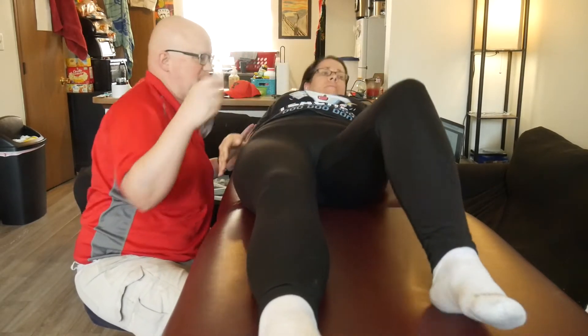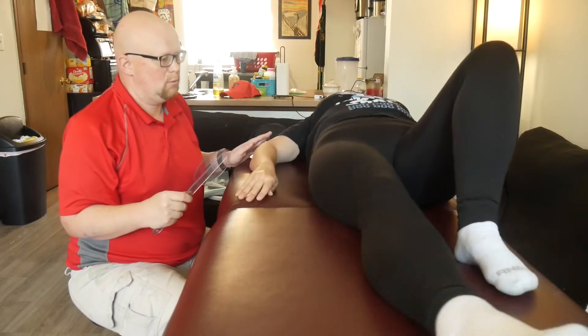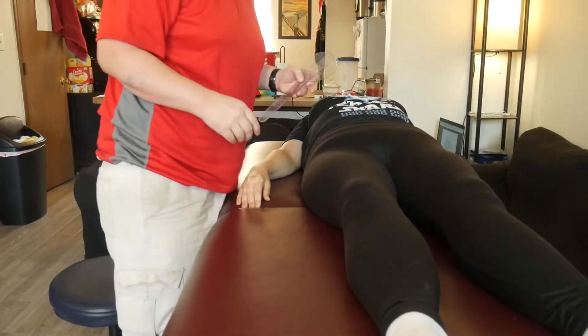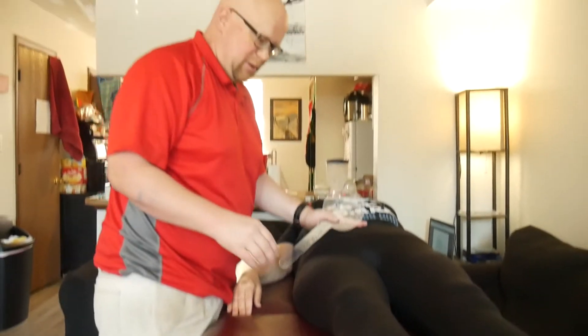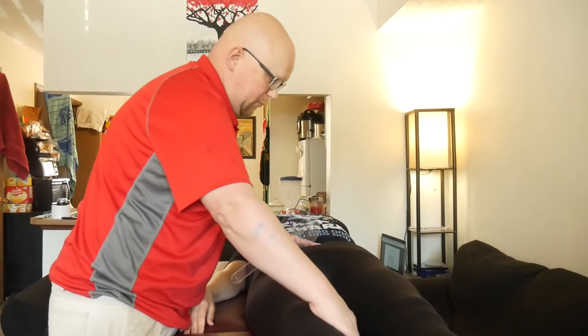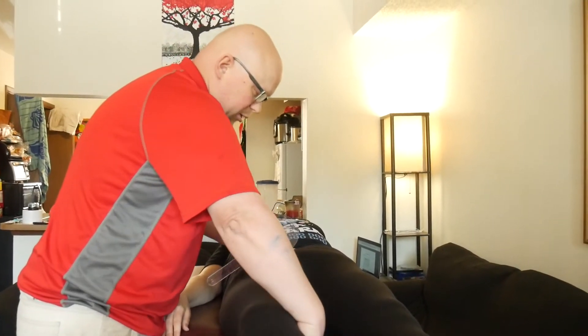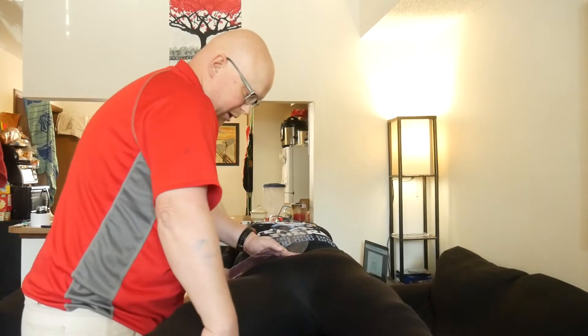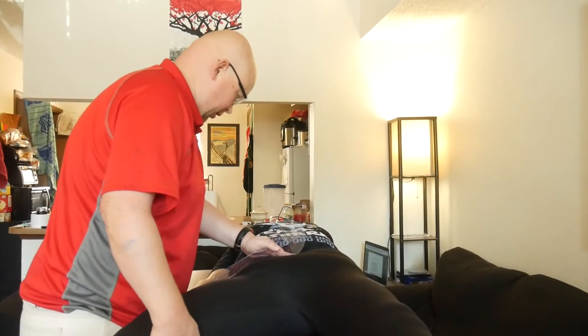So can you scoot over to that side for me? And this one you're going to really have to stand for. Some of the hip ones you can sit for, but this one you're going to have to stand for. Sorry to my cameraman. So what I want you to do, Karen, is just keep your leg straight, your knee straight, and bring your leg out as far as you can.